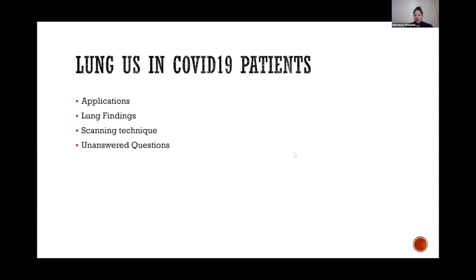The one thing I would just caution everybody with is that with echo, if you have no experience from before, then all of a sudden starting to do echocardiogram without an expert in the field that can help out can be somewhat tricky. And there's a lot of over-reading or underestimating what you're seeing or overcalling that can be quite problematic in the field. But I think it's still important to start with the basics. And of course, when it's possible to do hands-on training with echo, I would recommend that as soon as we can.